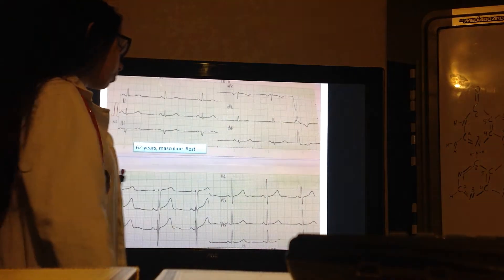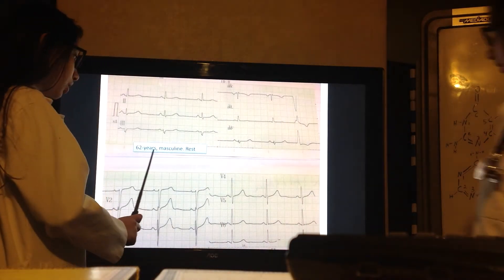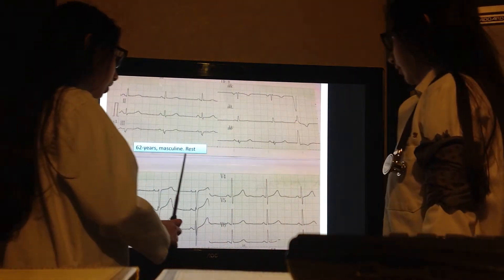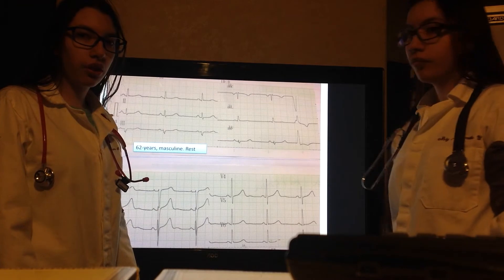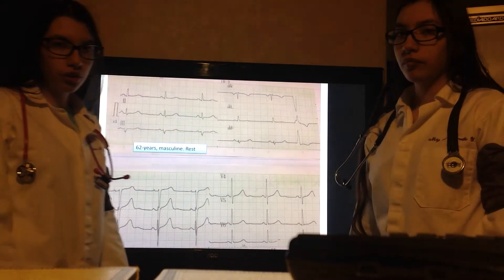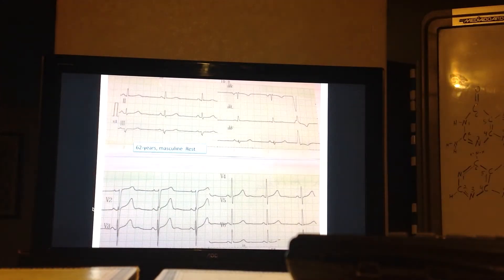This is the electrocardiogram of a 62-year-old male at rest. If you think you can do the interpretation, stop the video now and then continue to see if we have the same conclusion.